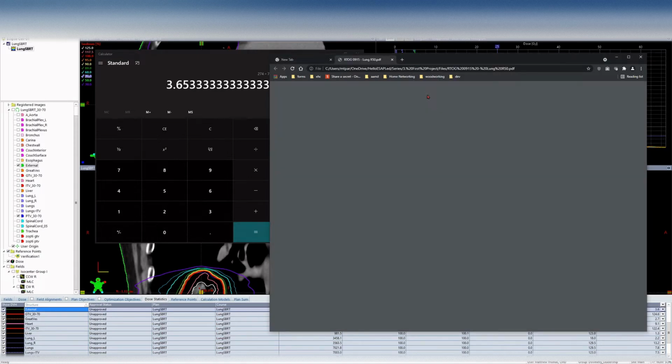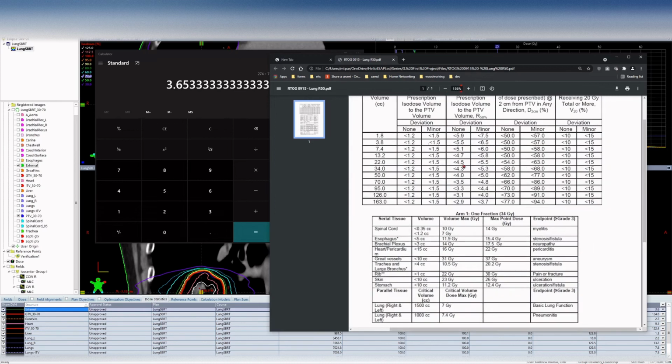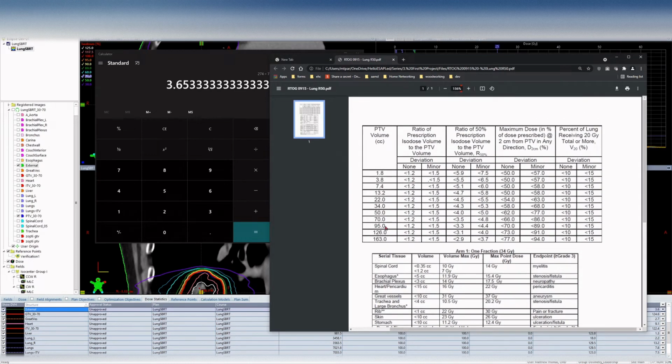So this right here, there's this table, and it's based on the PTV volume. So 75 cc's, somewhere between 70 and 95, closer to 70, would be the PTV volume. So you'd come over here and you'd say, okay, the ideal ratio would be between 3.5 and 3.3, and we just calculated 3.65. But there's a minor deviation that's allowed. You could be up to 4.8 and you'd be fine, or let's just call it 4.7. So you'd want it less than 4.7 or something like that.